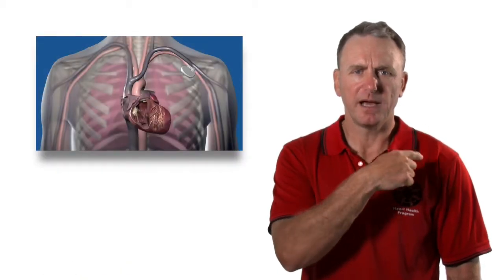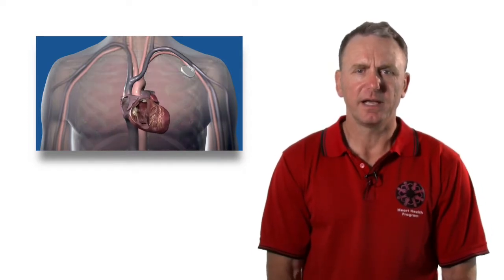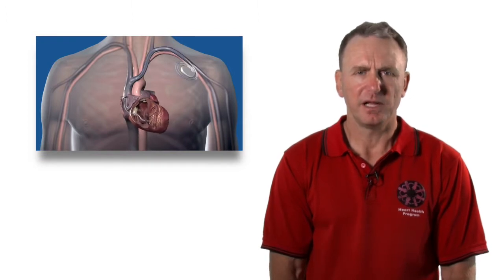So what happens with your pacemaker is they just pull open the skin, pop it down underneath your skin, and glue it back up. They don't have to stitch it. The pacemaker then sits in your body for the rest of your life. It has a battery life of about 10 years and it's very easy to replace the batteries.